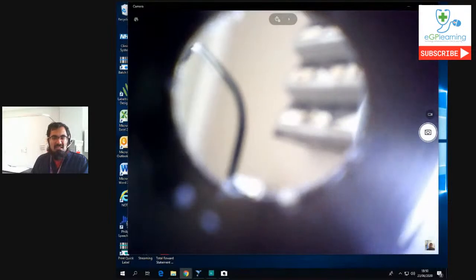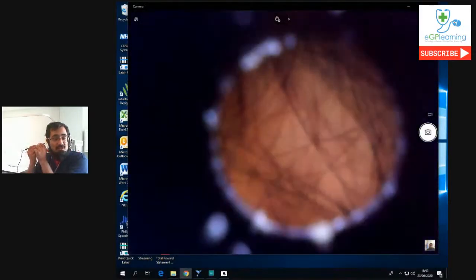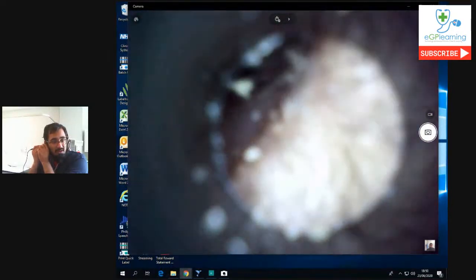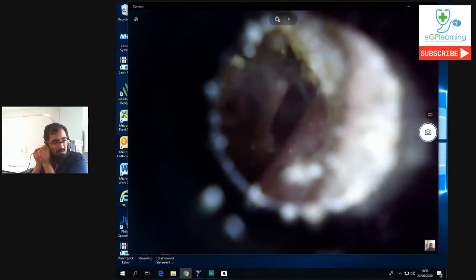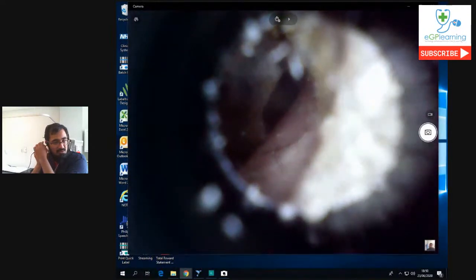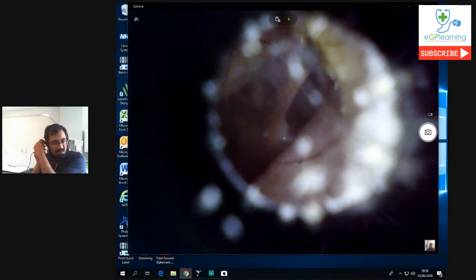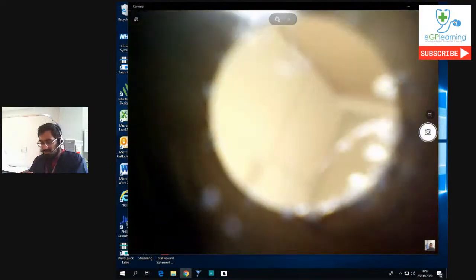So I don't normally do this in clinic, and apologies if you get any wax in this, but effectively just to show you the type of image you can get. Now, I will point out I can't manipulate the back of my pinna to pull it back whilst I hold it in. That's basically what my ear looks like inside. Now, normally, you pull back, you can get a slightly better image there. Obviously, my spatial handling skills are not the greatest when I'm trying to do that, so that's going in the bin. But that's the type of image you can get.